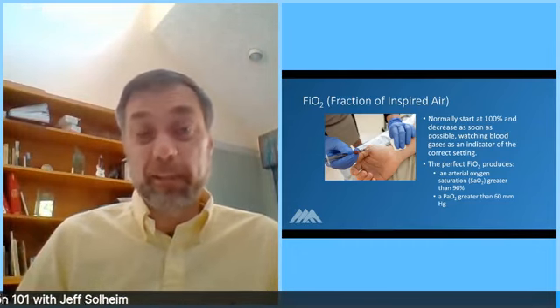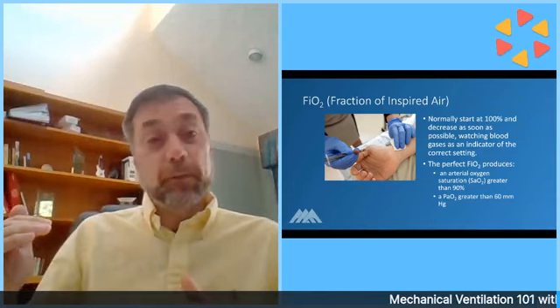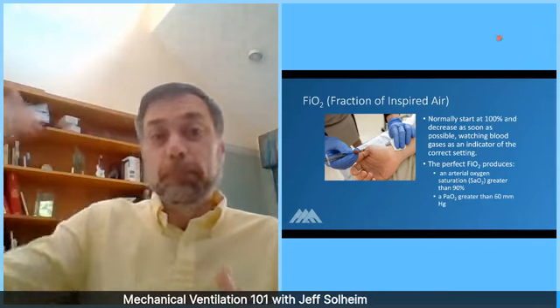Those would be minimum parameters that you look at. Obviously, we'd like those a little bit better, but those are the minimum parameters. So if you start dropping your FiO2 down and those parameters go lower, then you'd need to put your FiO2 back up.